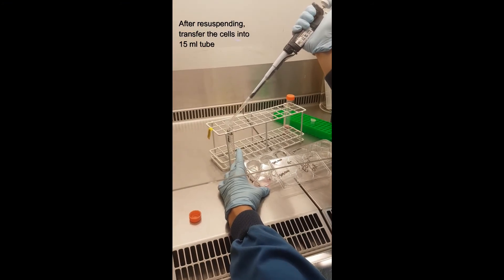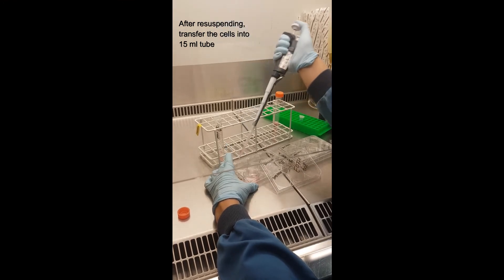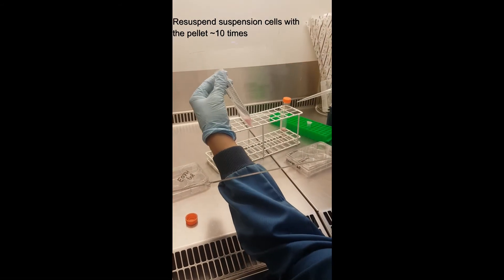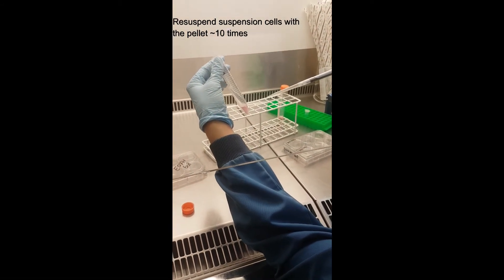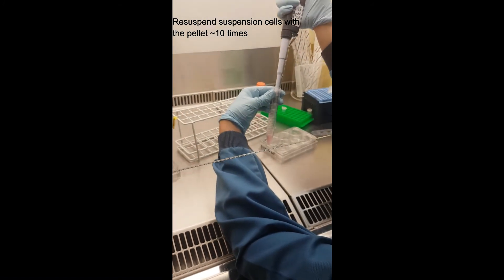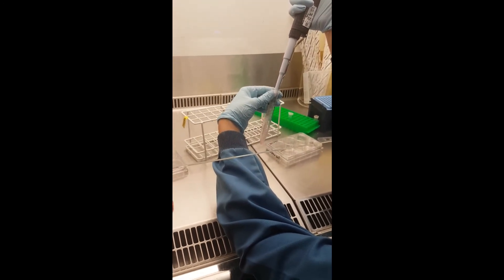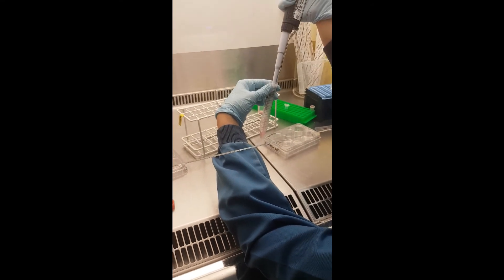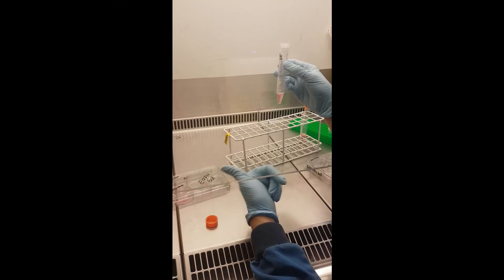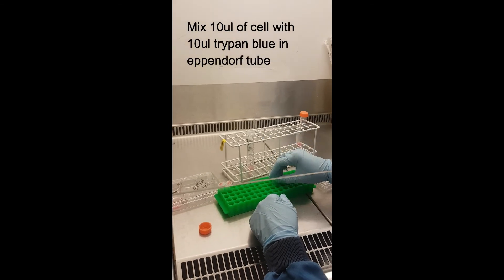After resuspension, collect everything here. Mix the pellet content with the rest — you have suspension cells from the medium and adherent cells after trypsinization — mix about 10 times, same trick to avoid bubbles. Now in 1 mL you have all cells collected, both suspension and adherent. For counting, prepare the tube with 10 µL trypan blue.